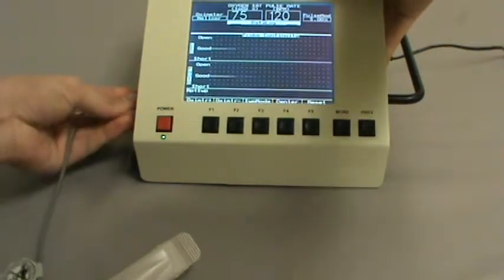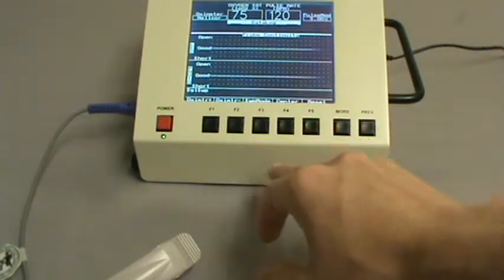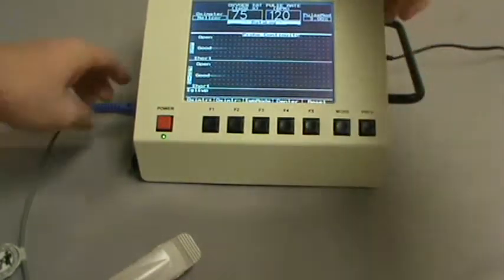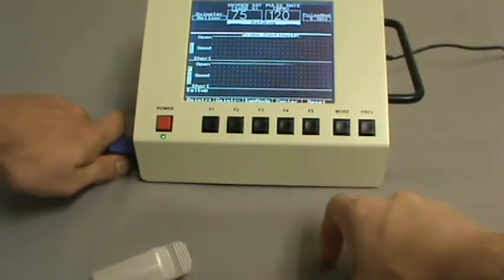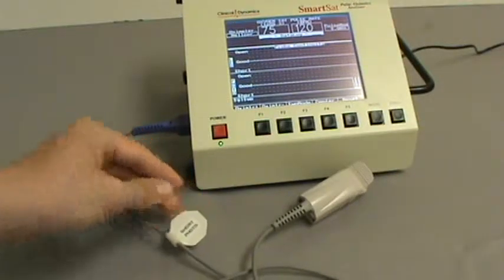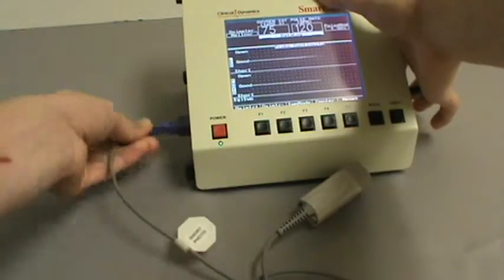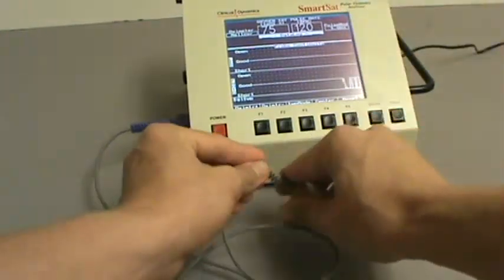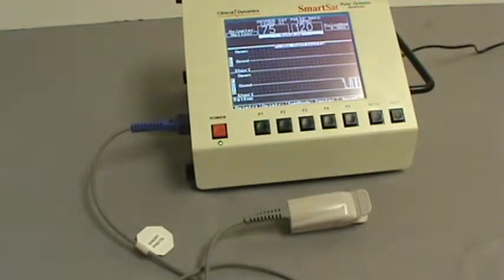In the last example, we used repetitive sweep, which tests continuously. In some cases, though, you may want to use single sweep mode, which stops sweeping on any fault. To switch, simply press Swap Mode. One thing to remember while testing probes is that in some cases the faults are intermittent, and therefore you should bend the cable in various places at any connection in order to test for breaks.